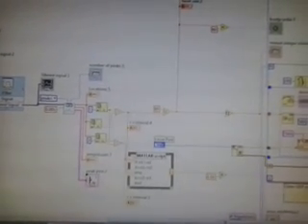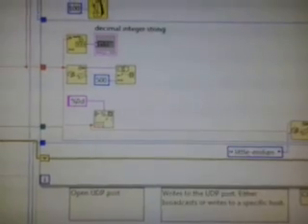In this user datagram protocol, in the server part we open the UDP port, we initialize the port at first, write the UDP port either broadcast or writes to the specific host. Then we close the data. In this, the data is transferred in the form of strings. So we convert the heart rate that is in the numeric form to a string form. And we close the UDP port. This is the part of server.